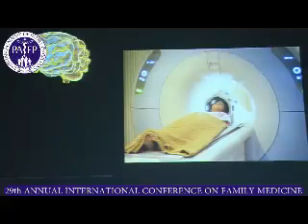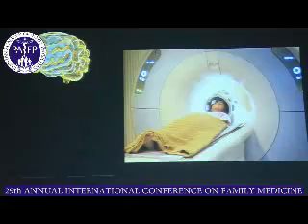The practice is that now all such metals are MR friendly, so there is no problem with any of the available stents. Then the next question would be that this patient has had a stent placed about 10 years ago. Would that be a reasonable and safe practice to place him in an MRI? Even then it's not an issue because they become epithelialized. The problem with the older versions, two decades ago or so, was that they would heat up, as we did not really test whether they were MR friendly or not.